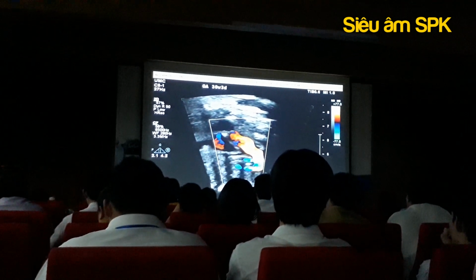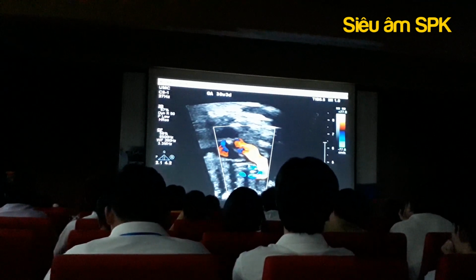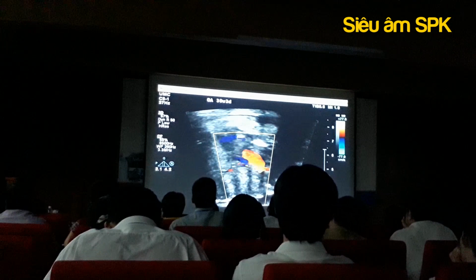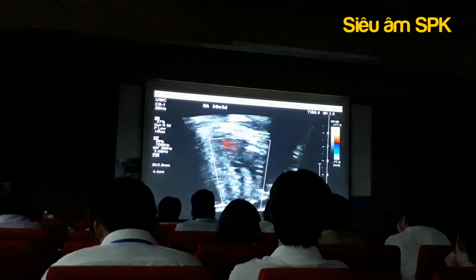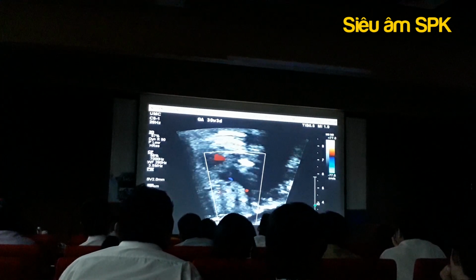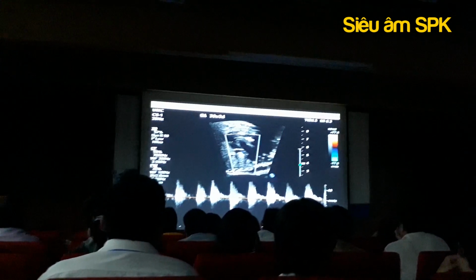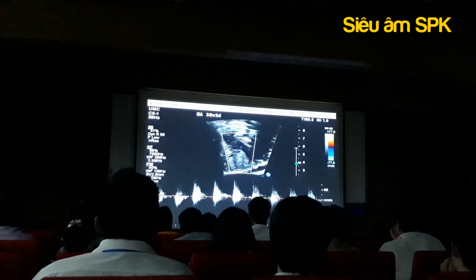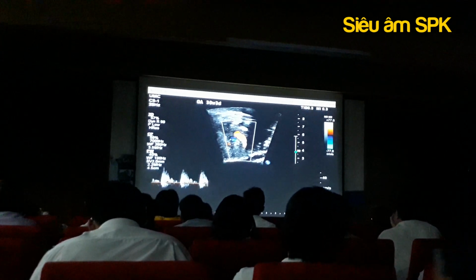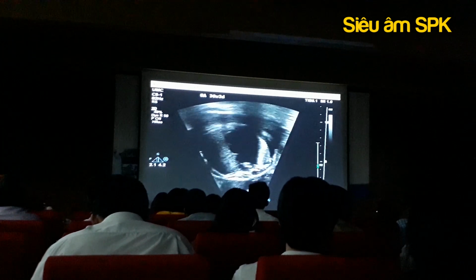So, ascending aorta. Small vertical ductus perfusing the right pulmonary artery retrograde, arising just below the arch and feeding the right pulmonary artery branch. And then there's the pulmonary artery going out into the lung. If there's any question about whether or not that's a pulmonary artery, I'm going to Doppler. Doppler doesn't lie. And looking like a typical arterial signal, something in between a ductus and a branch pulmonary artery. So that is the right pulmonary artery.